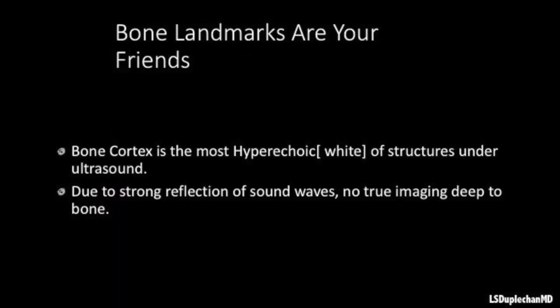Bone is the most hyperechoic of structures since all waves bounce off of it. As a result, there is no imaging deep to bone. This is sometimes called bone shadowing or posterior acoustic shadowing.